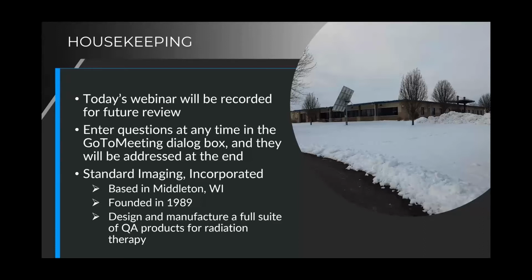And just a bit about Standard Imaging. We were incorporated in 1989, so we've been around about 33 years now. We're based in Middleton, Wisconsin, just outside the University of Wisconsin. We have an excellent relationship with not only the cancer center there, but the calibration lab as well that does all the calibrations for our ion chambers and electrometers.